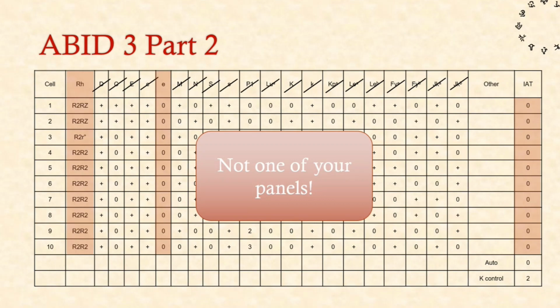So we would also do that first confirmation just to see, right, what is this? I think it's a little e, so we would use this panel. Oh, I've just given an answer there, sorry. So what you might notice about this panel is that all of the reactions are negative. But if you look right down at the bottom, we do have a K control, which is positive. This is just a weak anti-sera control. This is an incubation control, just to show that the test has actually worked.